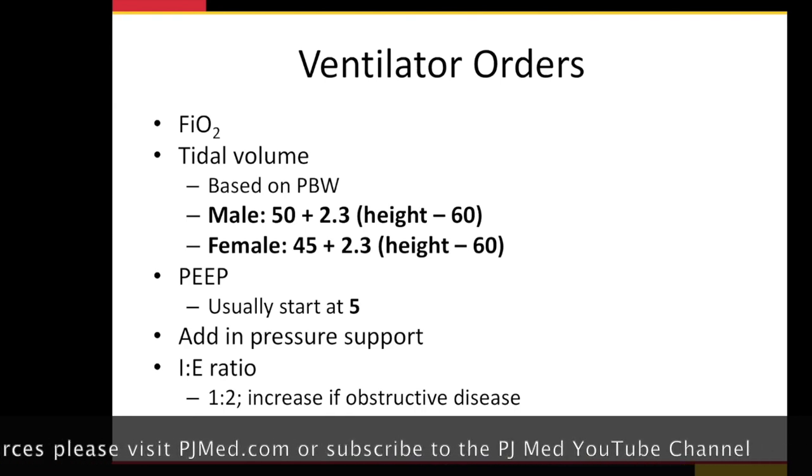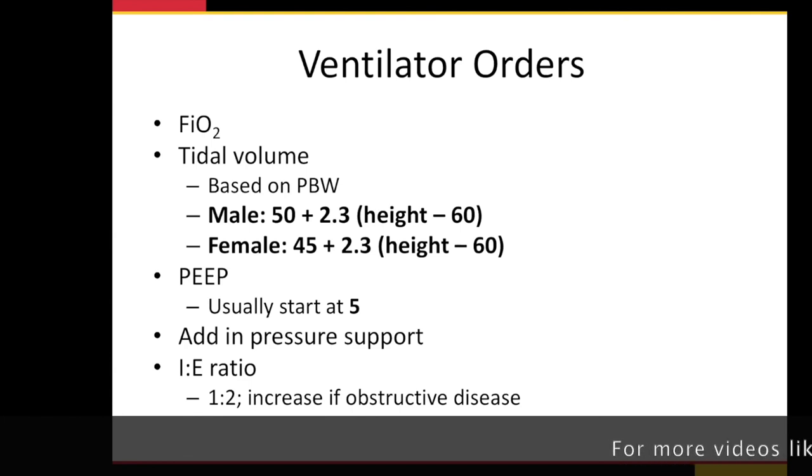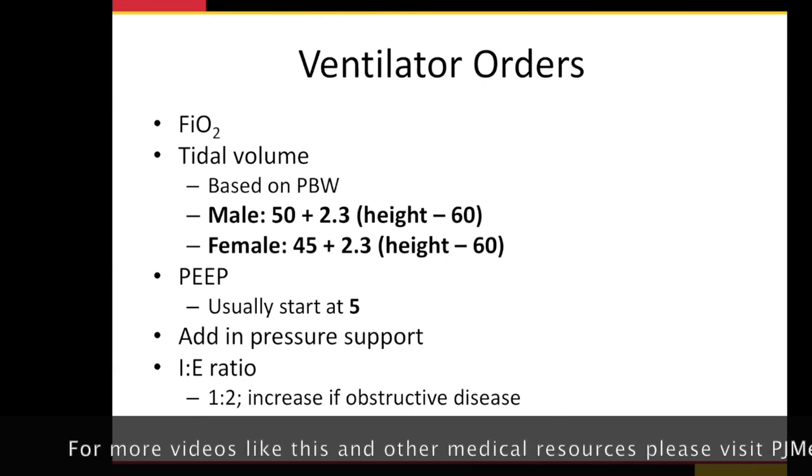PEEP, that's your end expiratory pressure. We start that at 5. You're never going to be wrong to start at 5. It's wrong to start at 0, and I'll show you a couple things in a second on that. You can add in pressure support if you want. That's advanced. I wouldn't worry too much about that.